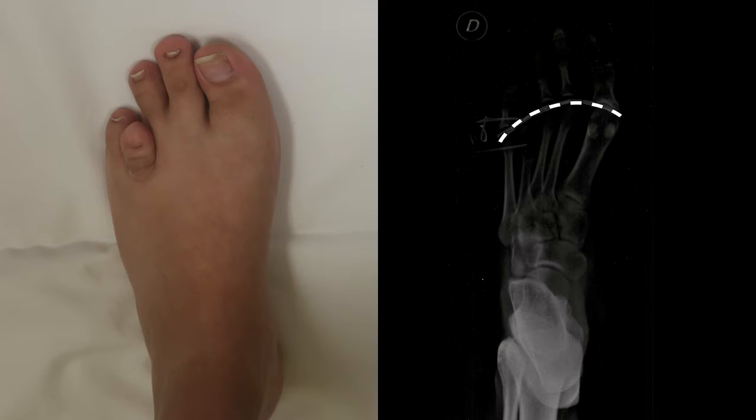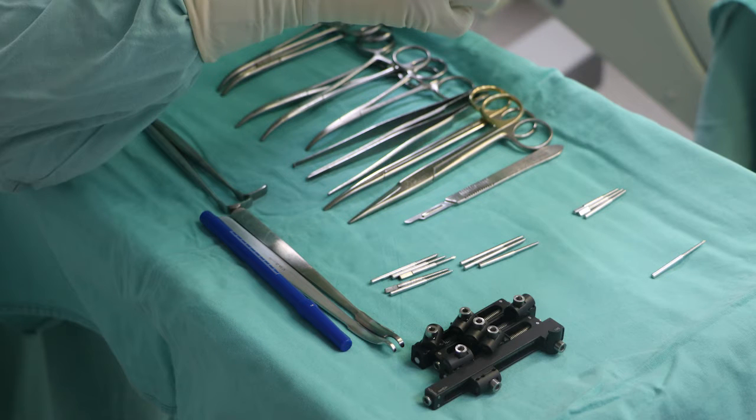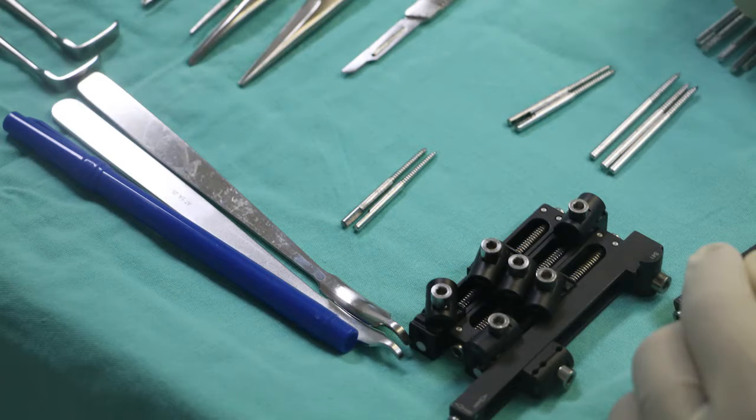This clinical and radiographic picture of the patient shows the interdigital crease between the 3rd and 5th metatarsal bone, a pathognomonic sign of brachymetatarsia disease. It is necessary to contemplate the equipment needed, which includes the mini external fixator, 3 mm cortex bone screws for each foot, and the mini-Hohmann retractor.